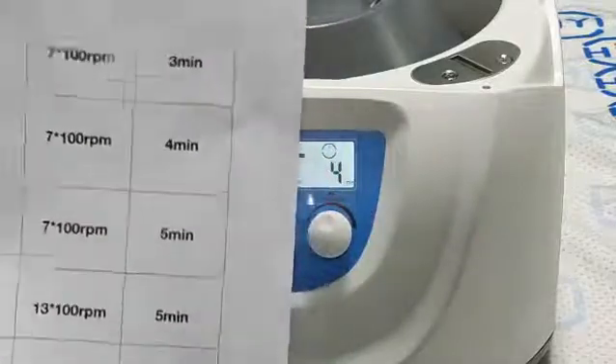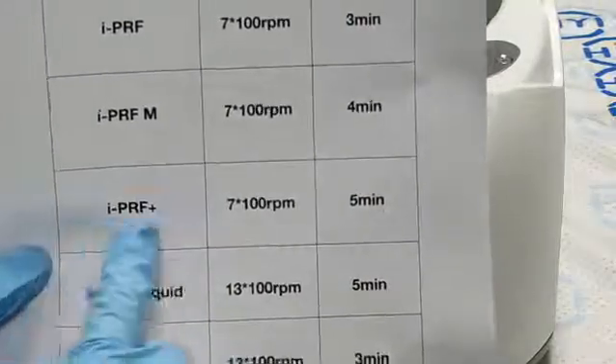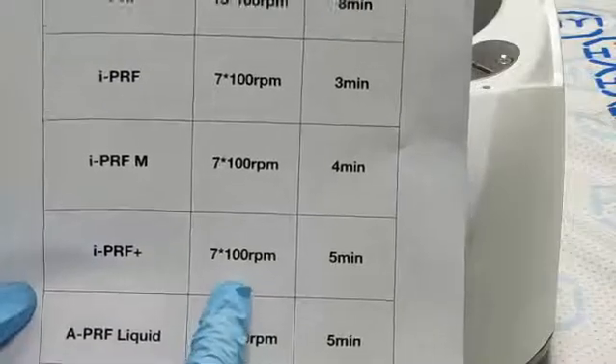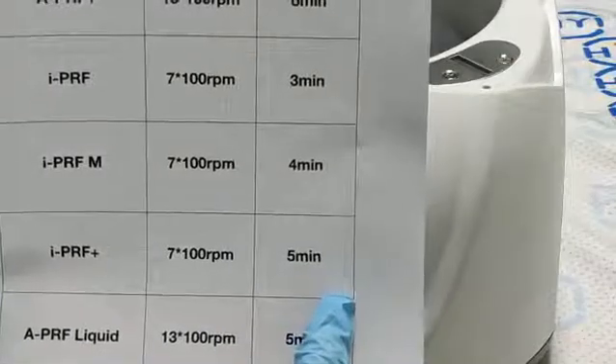The next one is program 4. It's i-PRF+. Its speed is 700 rpm and time is 5 minutes.